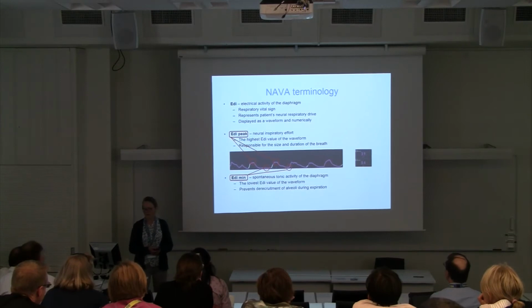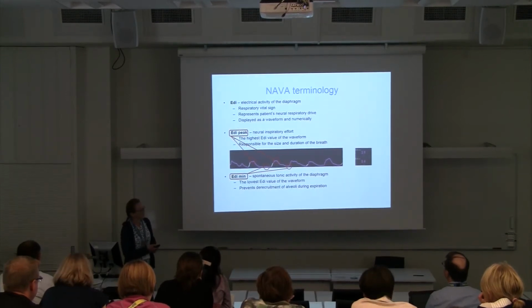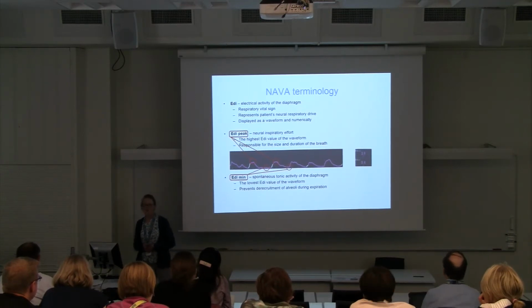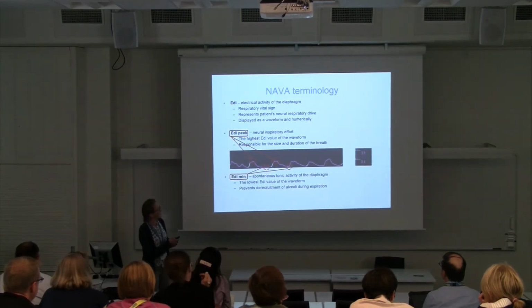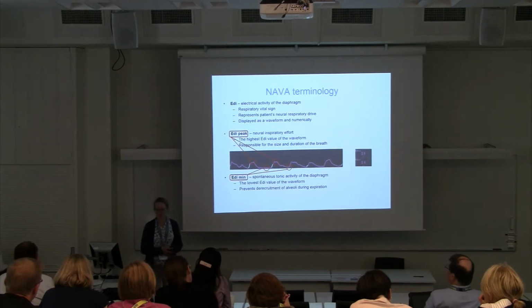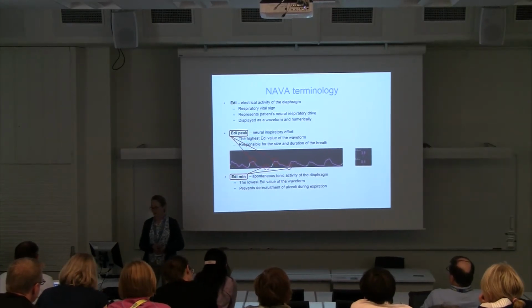The EDI peak value is the highest value on the waveform, and it represents the neural inspiratory effort. It is responsible for the size and duration of the breath. The EDI minimum, on the other hand, is the lowest EDI value on the waveform. It represents the spontaneous tonic activity of the diaphragm, and it prevents the de-recruitment of the alveoli during expiration.